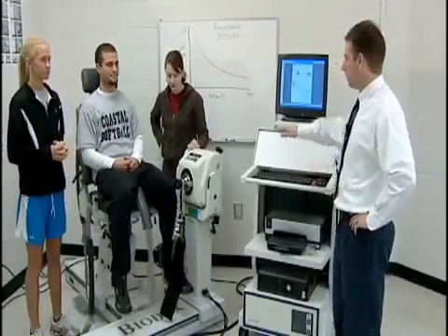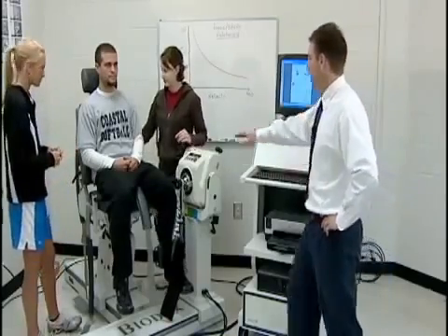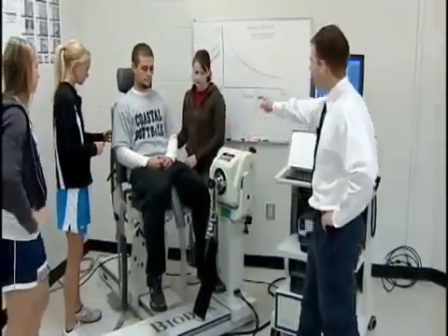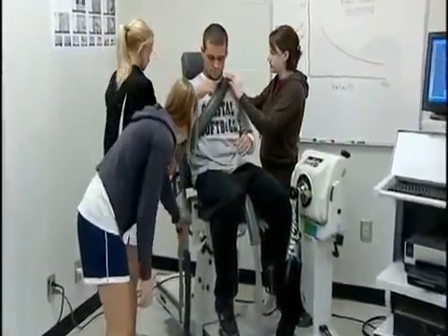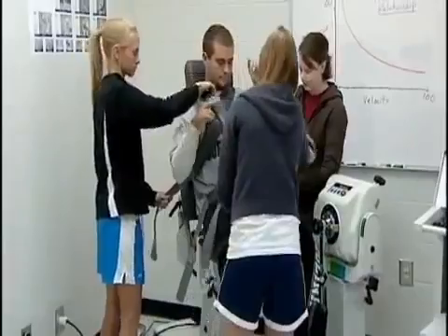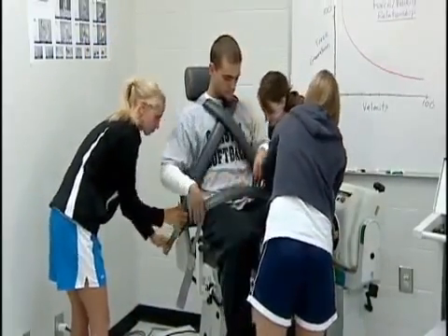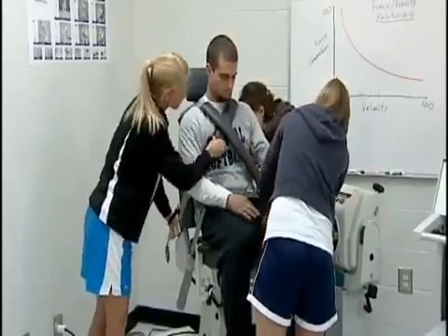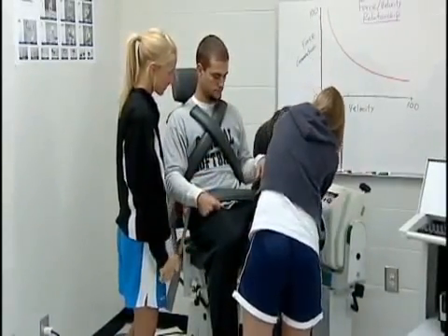We're going to do an isokinetic test on Zach. The first thing we need to do is strap him down so that we can isolate the muscle groups we're going to be testing — the quadriceps and hamstrings. We'll bring the straps around over his shoulders and upper body, and we want those to be kind of snug.